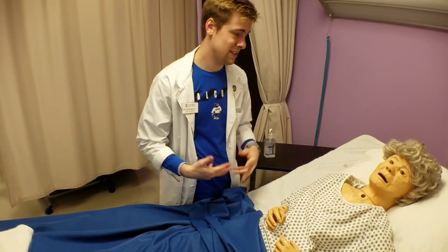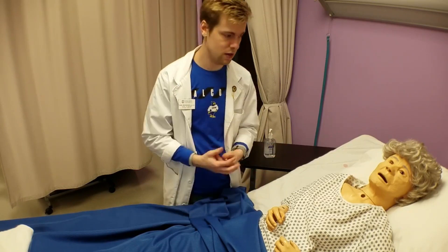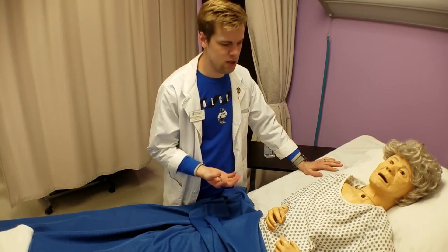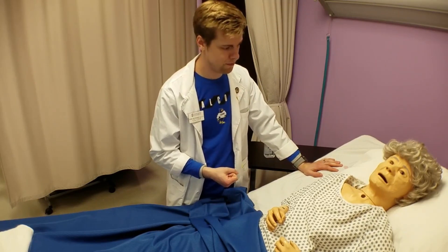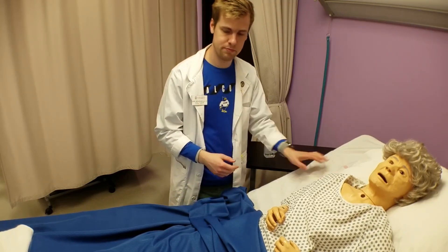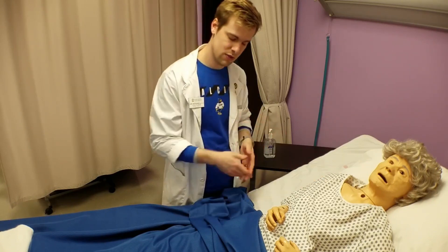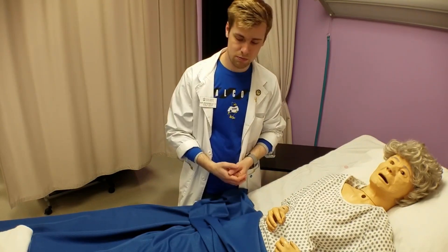If you haven't already, raise the bed to an appropriate working height. Then wash your hands and begin your assessment. Ask the patient about recent urine activity: have they urinated recently, any difficulty or pain, and do they feel like they need to go to the bathroom right now? Ask these questions to help avoid an unnecessary catheterization.